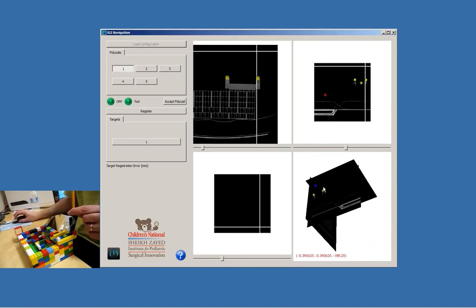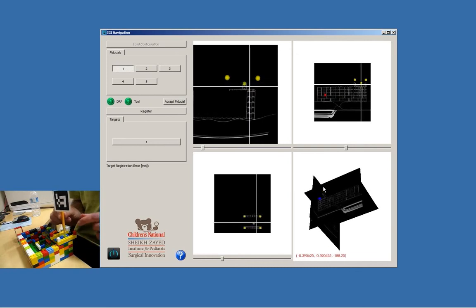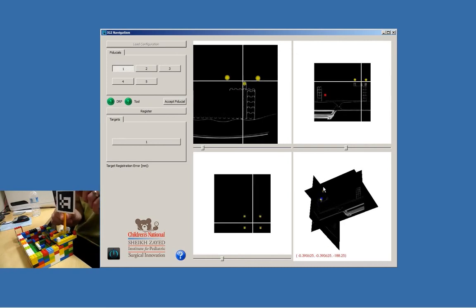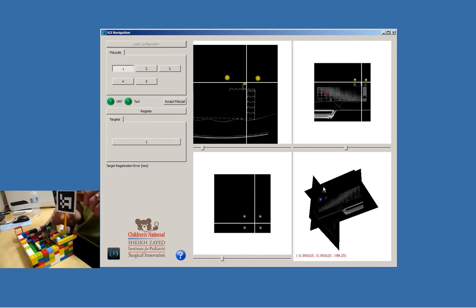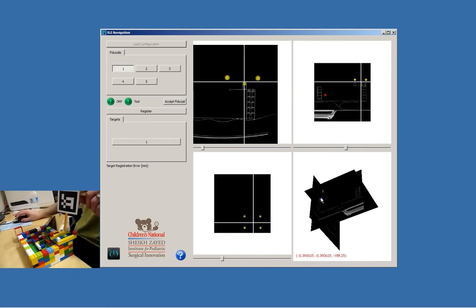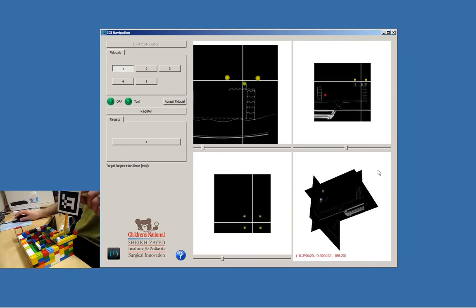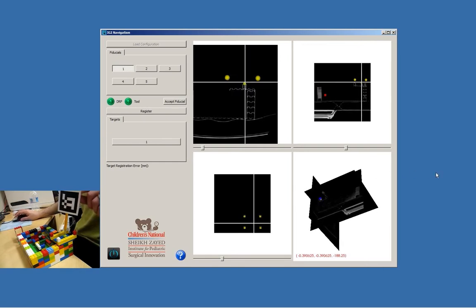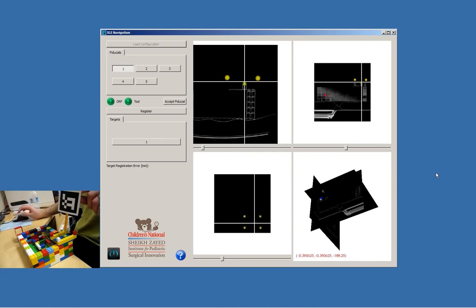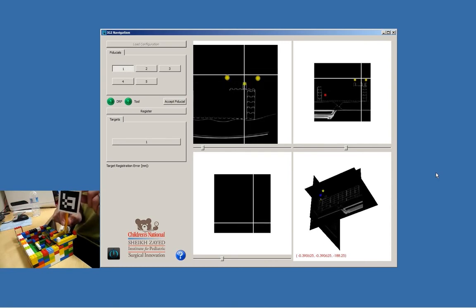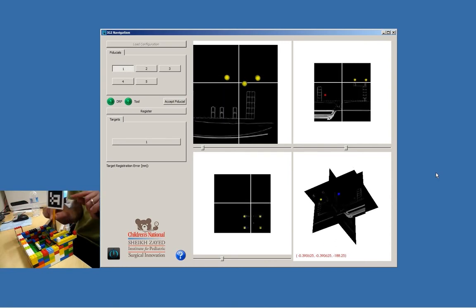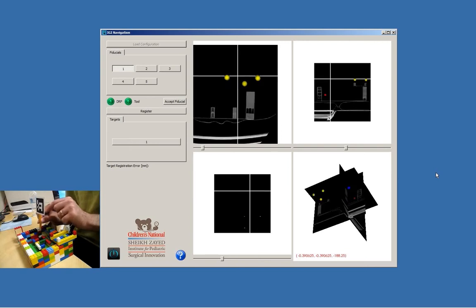Let's look at the image again. Here you can see that if I'm touching a fiducial, the blue sphere and yellow sphere are almost overlapping, and that's what we should see — there is now a correspondence between the physical world and the virtual world displayed on screen.